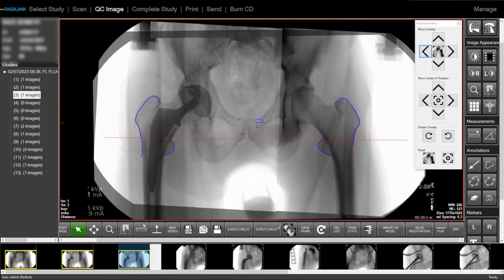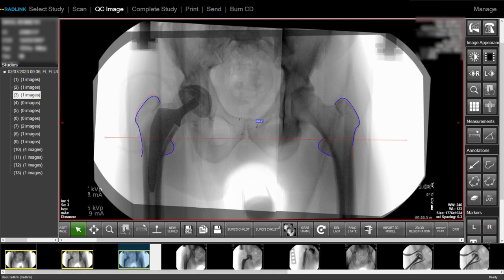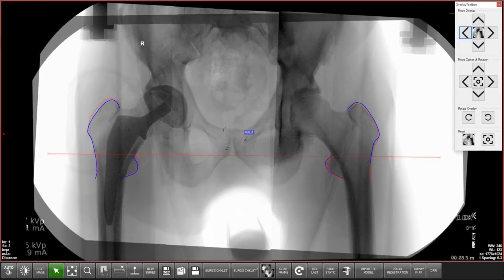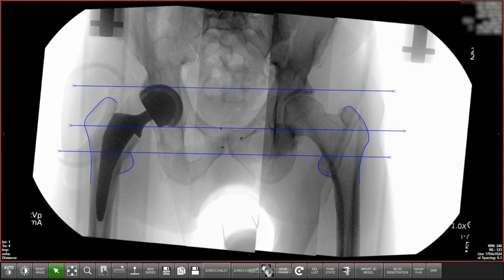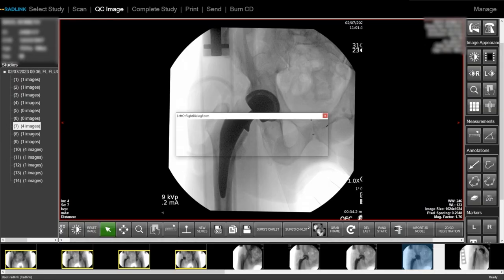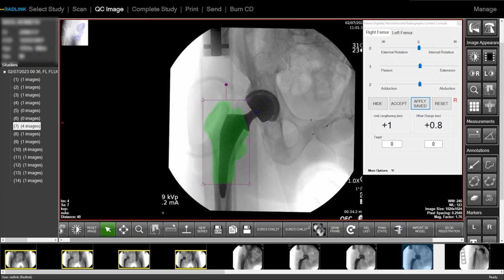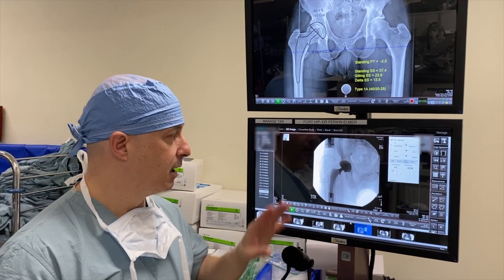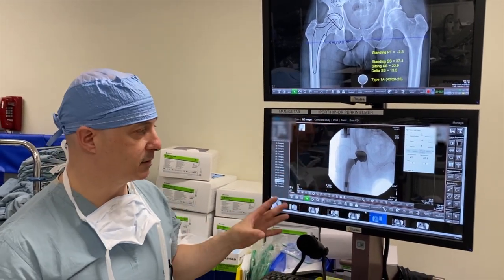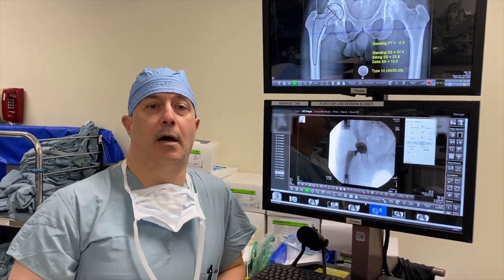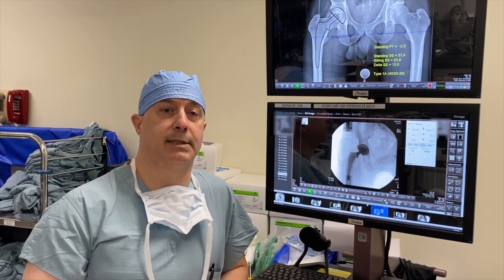Here's our final overlay. You can see the six high is in place. I've dropped down to a plus one-five trial ball and everything overlays beautifully — that's where we wanted to be. Here's the final with the final head in, and you can see if we draw our lines across, it lines up perfectly on top of the lesser trochanter. Going to our final 3-2-3 overlay, I got about one millimeter of length back and just under a millimeter of offset. With our goal of getting two millimeters, we're pretty much right on. This hip felt very stable intraoperatively, and I think this really illustrates three different ways that you can use RadLink to assess leg lengths and offsets.